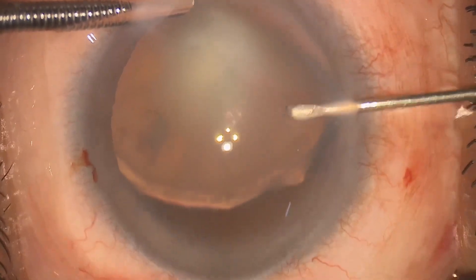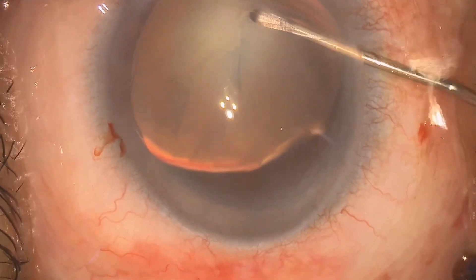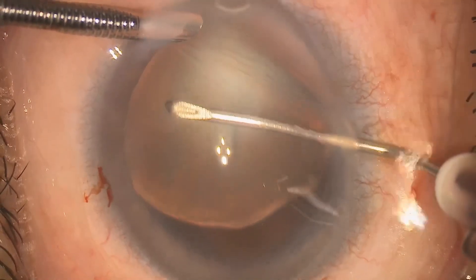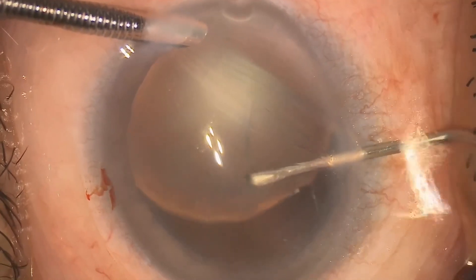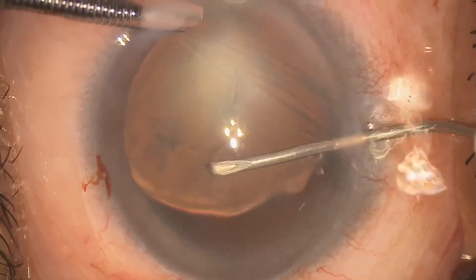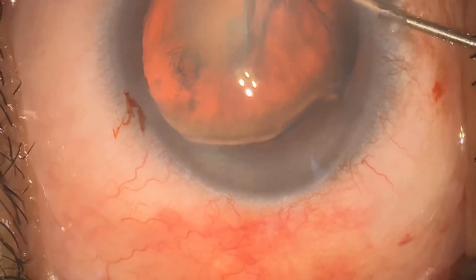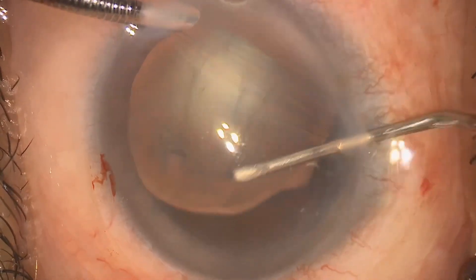Now let's start with the capsulorhexis. While performing the capsulorhexis you can observe anterior capsular folds, which is suggestive of zonular weakness. So while performing the capsulorhexis we should avoid any stress on the zonules and make sure we perform the capsulorhexis away from the dialysis area. I am trying to keep around 1 to 1.5 mm gap from the zonules, and the size should be around 4.5 to 5 mm. My preferred technique is with the modified cystotome for better control.